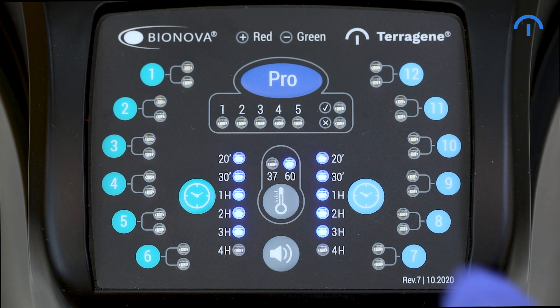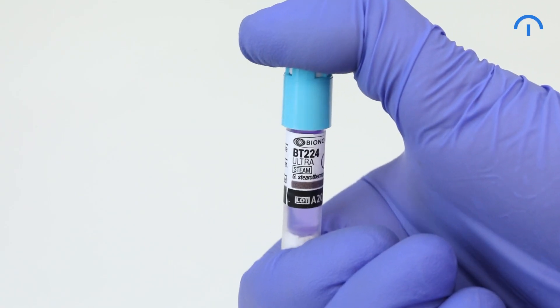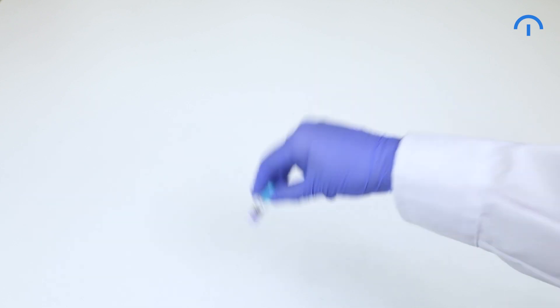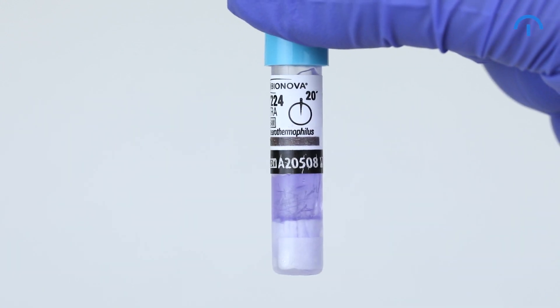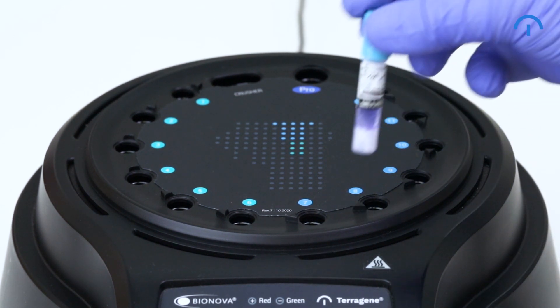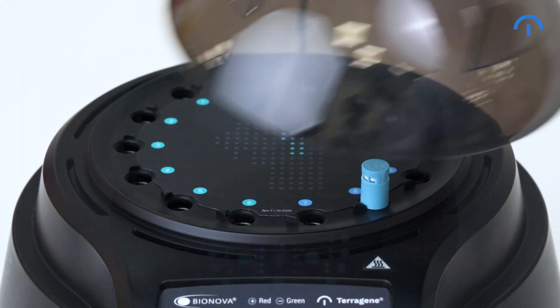Press the button to set the corresponding readout program. Press down the biological indicators cap. Break the ampoule using an ampoule crusher. Shake the biological indicator vigorously to ensure the culture medium gets in contact with the spore carrier. Now place the biological indicator in any of the six positions where you previously set the corresponding readout program. Close the lid and wait for the result.